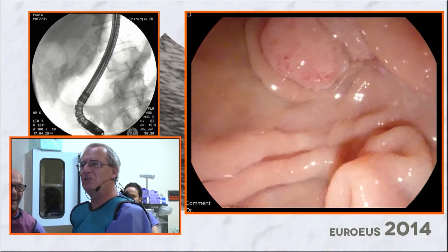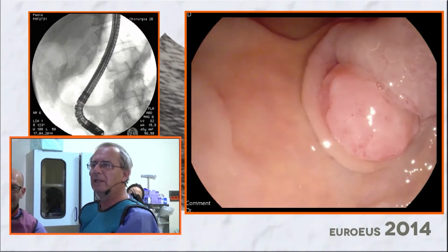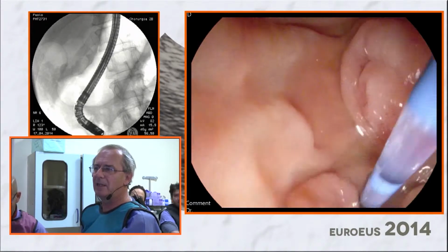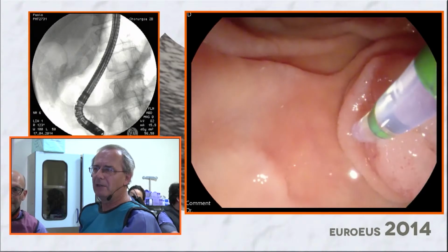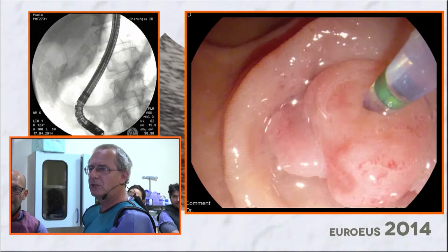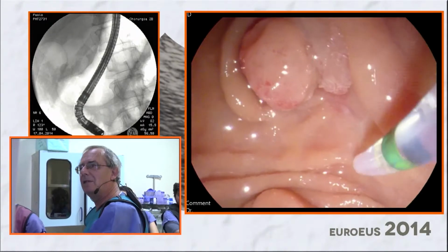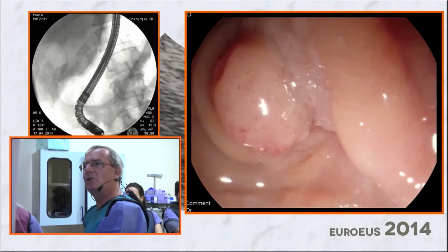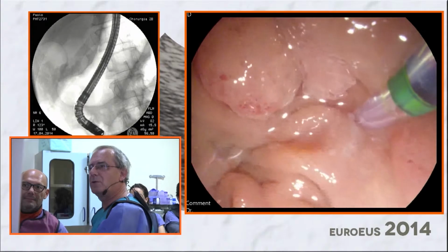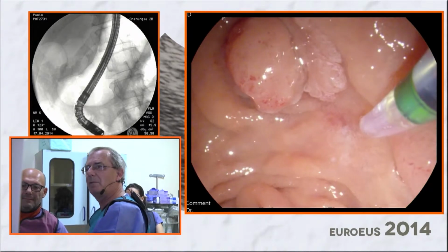It's a little bit strange because there is, you see, a central nodule, which probably has the orifice located here. This is, I think, the orifice. But then, under this fold, which looks normal, there is some tumor spreading here on the lateral edge of the papilla.